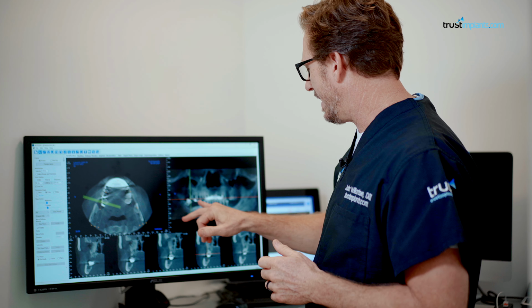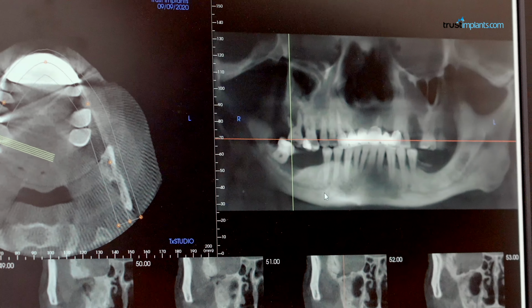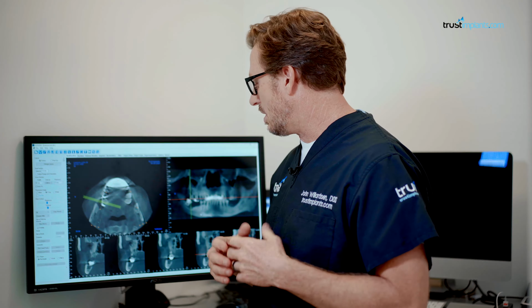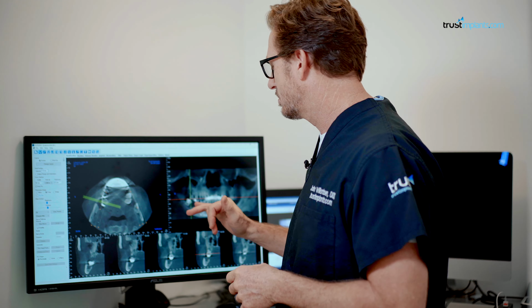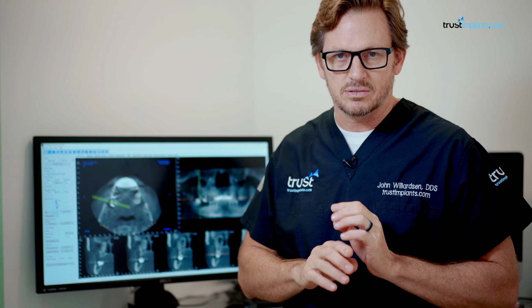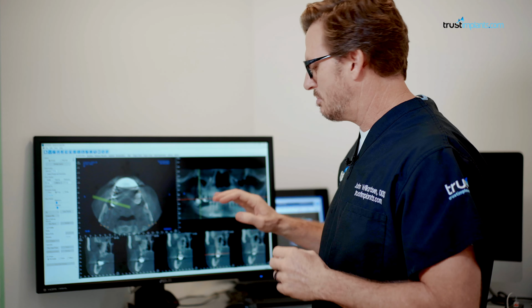So this patient has had a lot of dental work done. He's had crowns, fillings, root canals, bridges, extractions. So it's not like he hasn't tried to maintain and keep his teeth in check. But over the years, and actually once you lose that first tooth, it's the beginning of a snowball effect to where you really start to have issues. So my advice is to replace, if you have a tooth that's missing, replace it with an implant. Anyway, so back to this case.